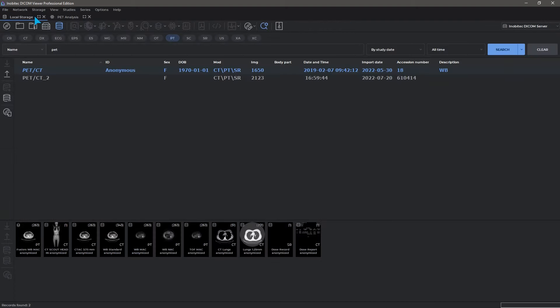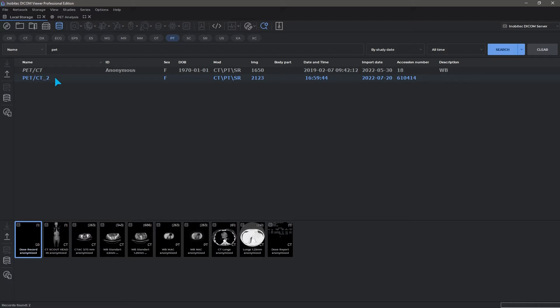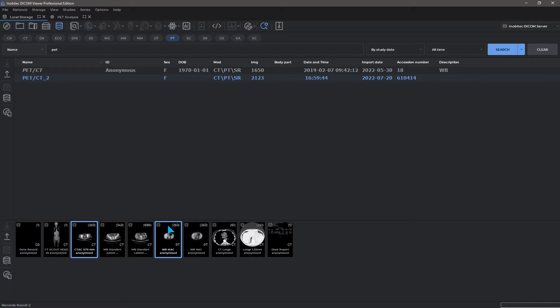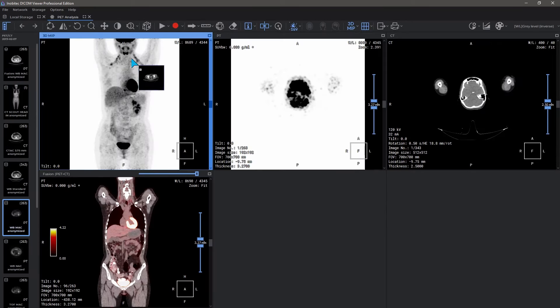There is an option to add another study to the same window, which allows you to follow the course of the disease. If you select PET and CT series at the same time, they will be merged automatically.